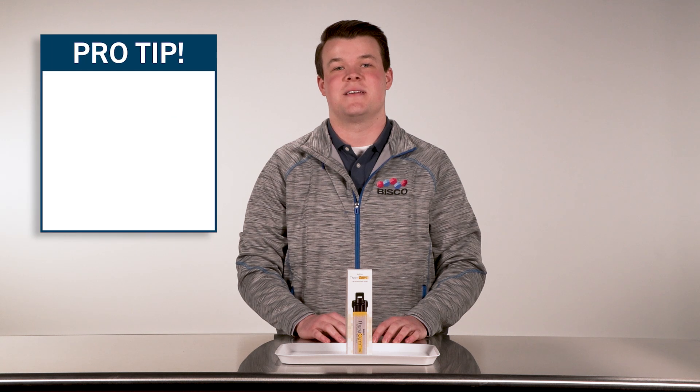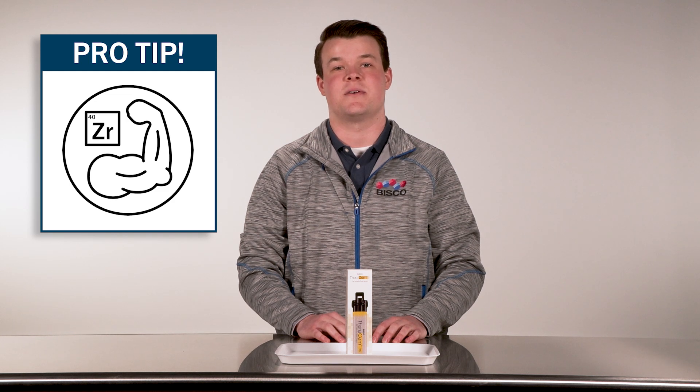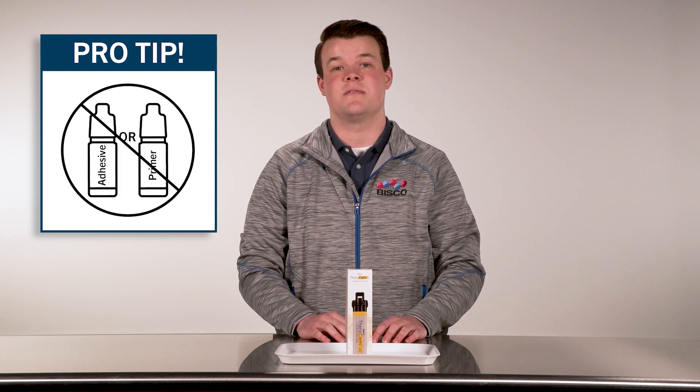Here's a pro tip to keep in mind. TheraCem's unique formula contains MDP that enhances the bond strength of the zirconia, metal, and the tooth structure, without the use of an additional adhesive or primer.